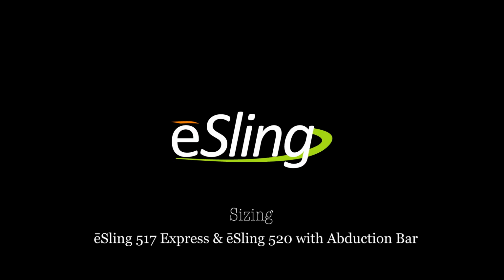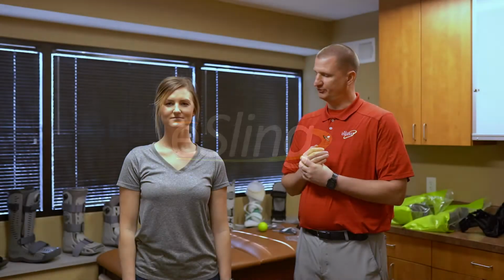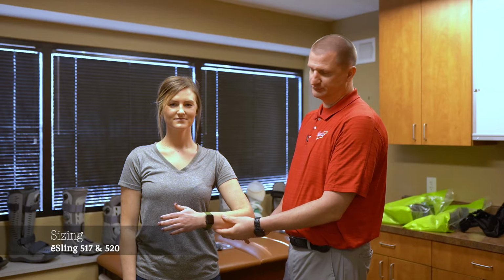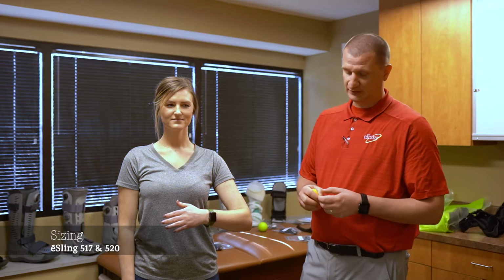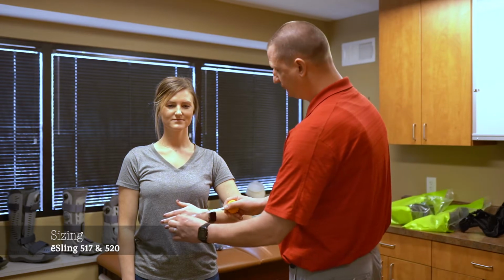When it comes to sizing of the patient, it's basically from the patient's olecranon, which is the tip of their elbow, to the third MCP joint, or the third knuckle. This sizing is just done with a tape measure in inches, where you take a quick measurement going from here to here. The eSling Express and 520 come in two sizes, and it's all based off of that measurement. A standard is from 11 to 13 inches, and a long, which is the second size, is from 14 to 16 inches.